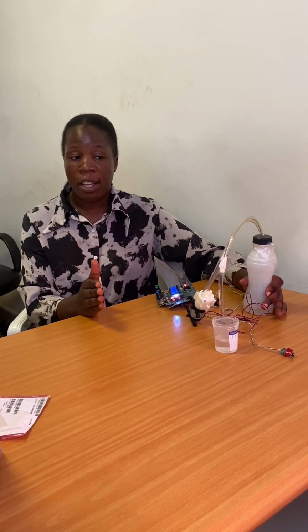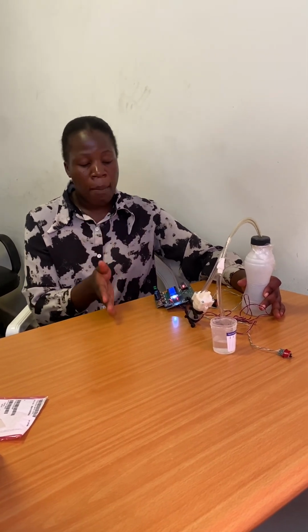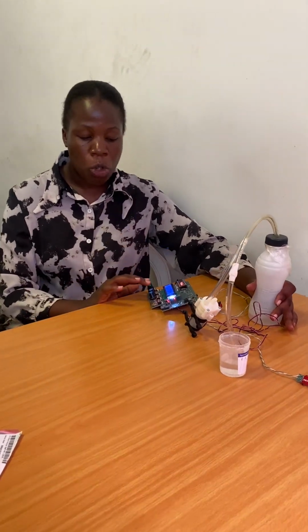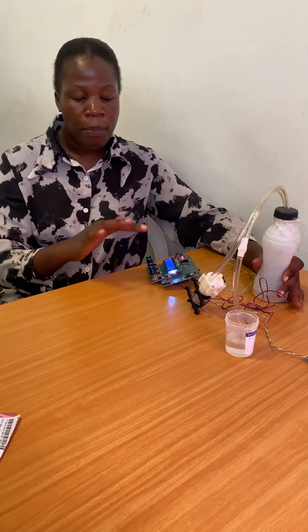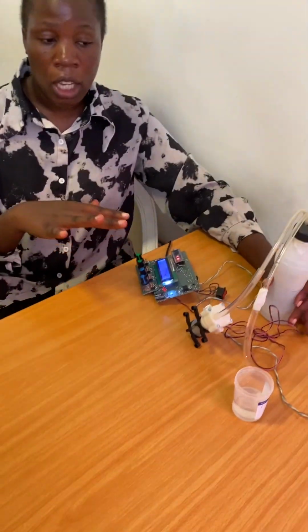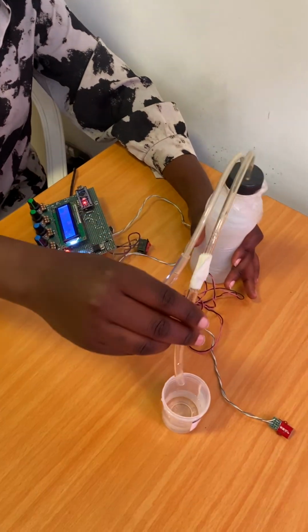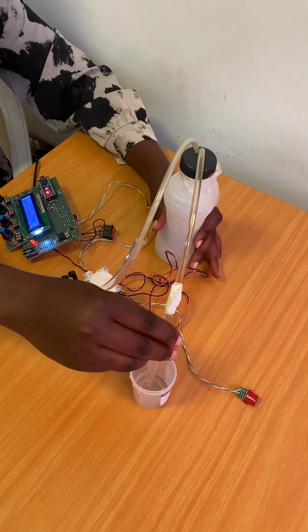When it comes to the success as a team that we have so far achieved, the first prototype that we designed has the pressure control knobs and the timers, and these are the ones that we are using to provide the intermittent pressures. And like you can see, it is actually doing what? Sucking.